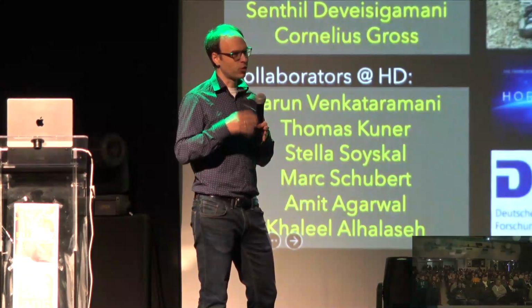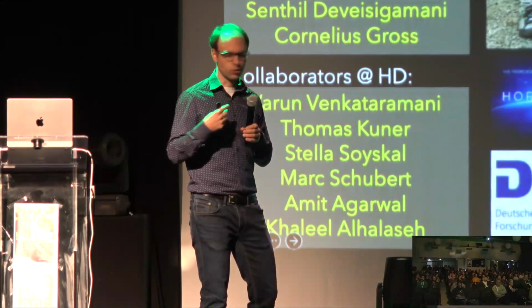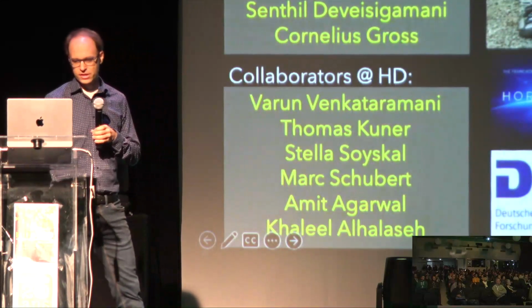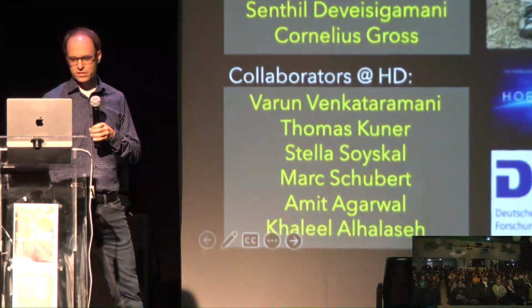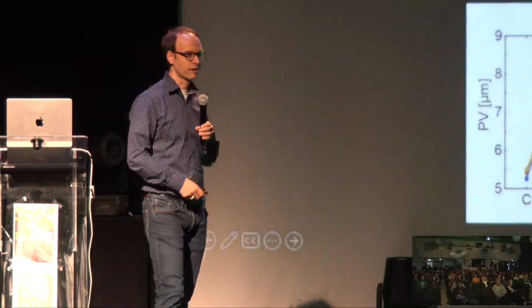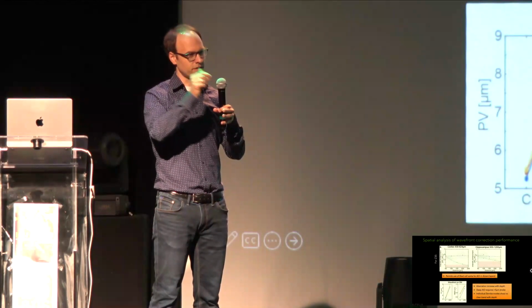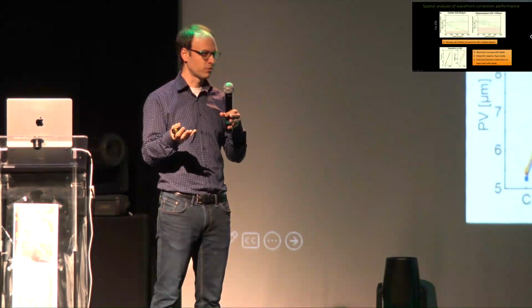So basically, when you go from one animal to the next, you really have to reperform the adaptive optics. As I showed with some of my isoplanatic patch analysis, the aberrations don't vary very quickly in space. So this is on the order of about a few hundred micrometers. So if you think of a volume, you have to perform a correction measurement every few hundred micrometers.